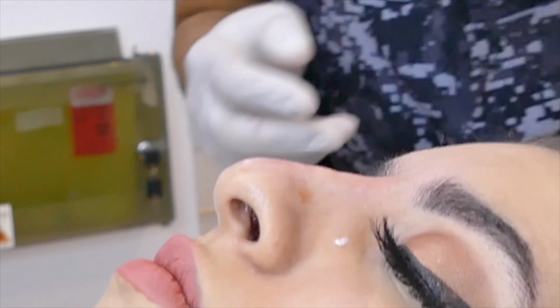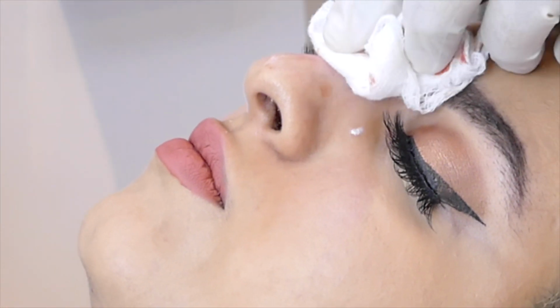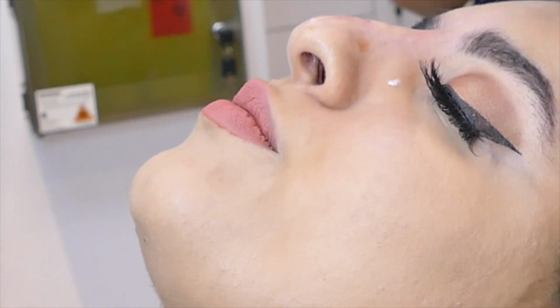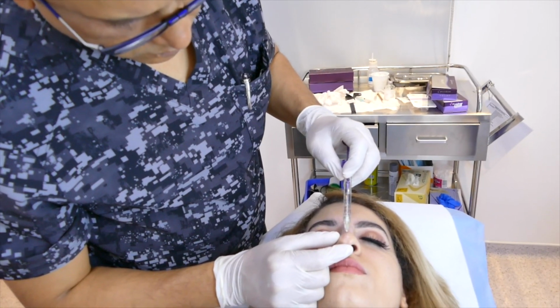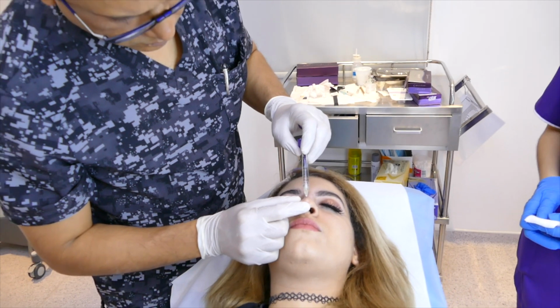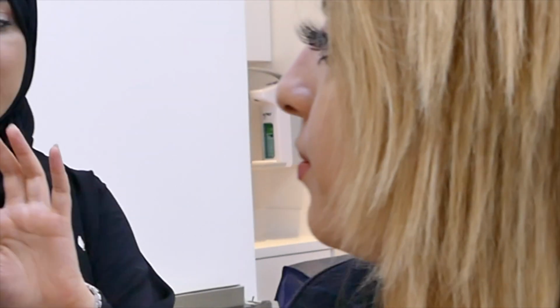So I have injected about 0.4 cc so far, and then I am going to build up the tip lobule. Again, just inject small quantity so it does not displace laterally and increase the width of the nose. So about 0.1 ml has been injected into the tip defining areas, and this is the end result of filler to the nose.